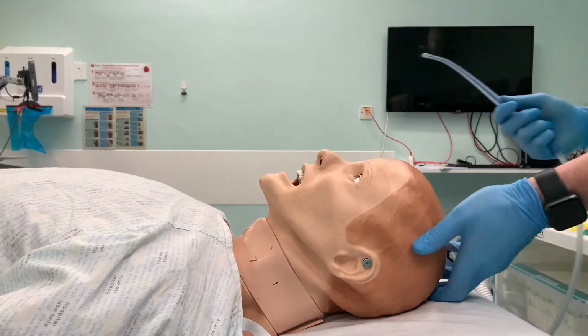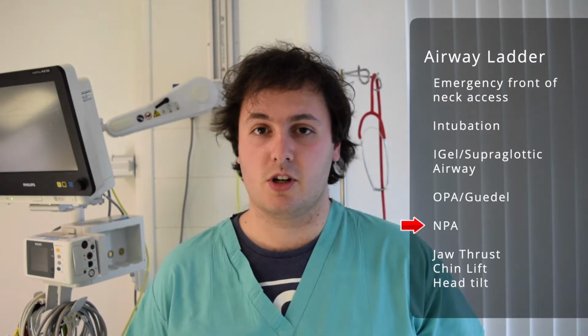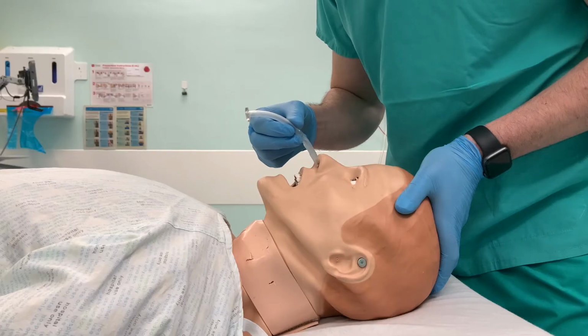Next, you'd consider the use of an NPA or nasopharyngeal airway in order to gain better oxygenation to the patient and management of their airway. These are well tolerated in patients who have normal GCS. To size these, you'd want to just use your judgment. There's no formal sizing method. You might have heard of things like using your pinky or finger size of the patient, but actually the best way is just to get your NPAs out and work out which one fits in best.